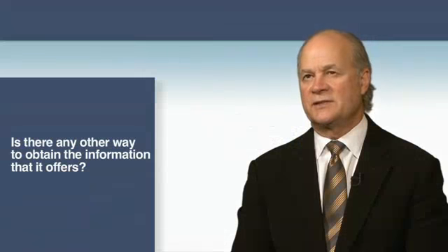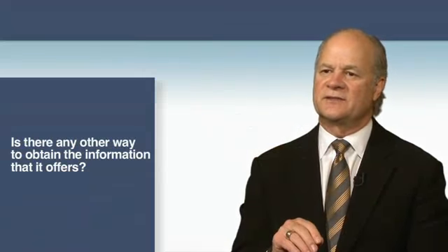I think the biggest thing about this is it simplifies the way to get this information, because at a slit lamp, if you're really looking carefully, you may be able to see the scatter of the light in the tear film. You may be able to see by a little bit of increased density in the beam of the slit lamp that the cornea is a little denser. You may be able to look at the lens in the eye and say there may be some scatter of light there, but it doesn't give you an objective measurement, and we certainly can't compare it from one doctor to another one. So this gives you an OSI reading, which is your optical scatter index, and it gives you a score.